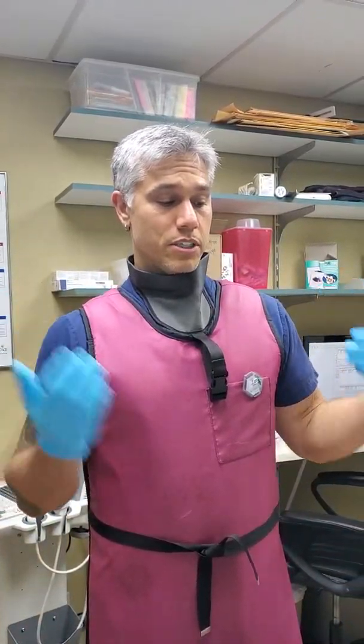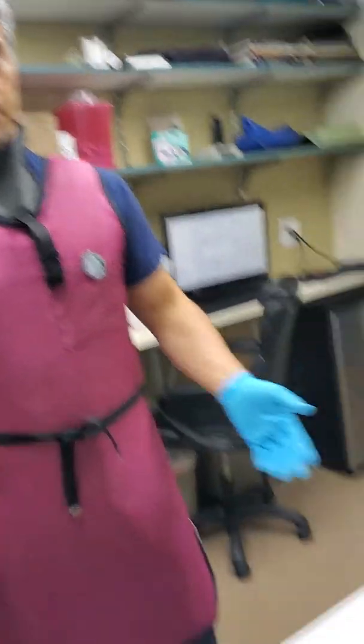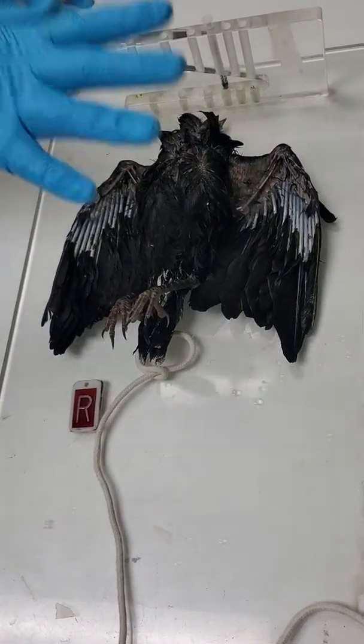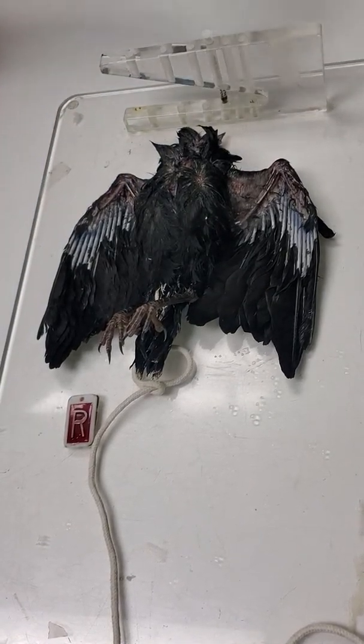Hi, my name is Andrew Jacobs, and I'm going to show you how to position a bird for x-rays. I'm going to show you how to do two separate views. The first one I'm going to show you is a ventrodorsal view, or a VD view.